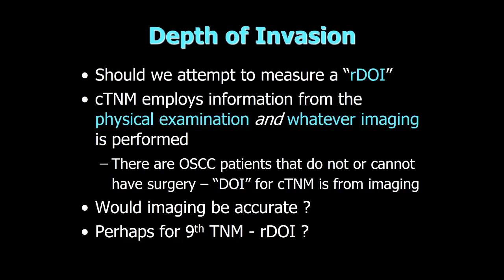So when this new concept of depth of invasion came into effect, one of the things that we asked as radiologists is, should we be trying to give a radiographic depth of invasion measurement so as to be able to help stage according to the new T staging format? If you take a step back, the staging manual actually states that when you stage clinically, you can employ information gathered from the physical examination as well as any imaging performed. So as a portion of the patients may not or cannot undergo surgery, if there is any desire to actually stage using the concept of depth of invasion, that will have to come from imaging.